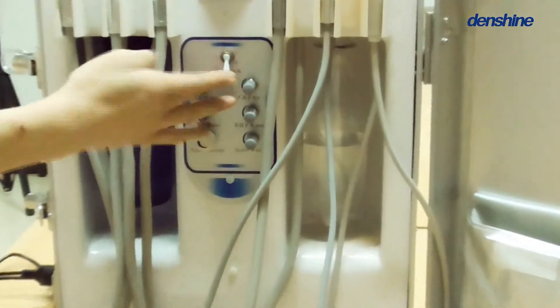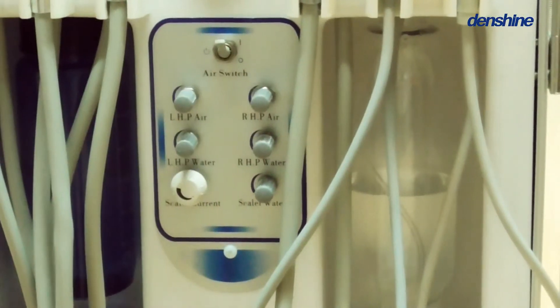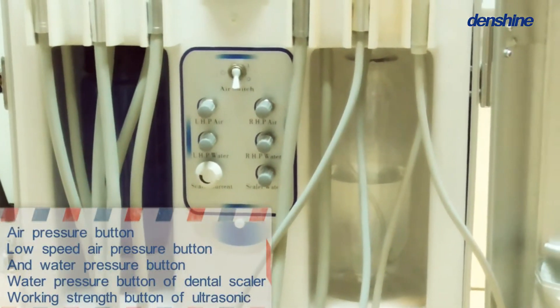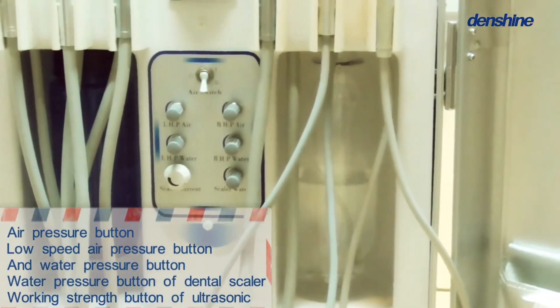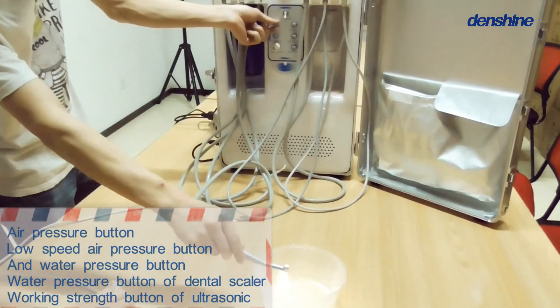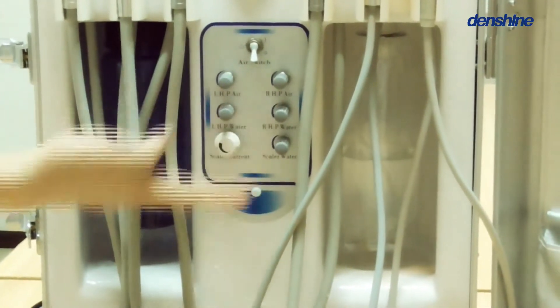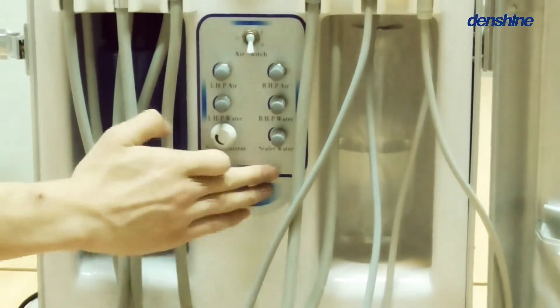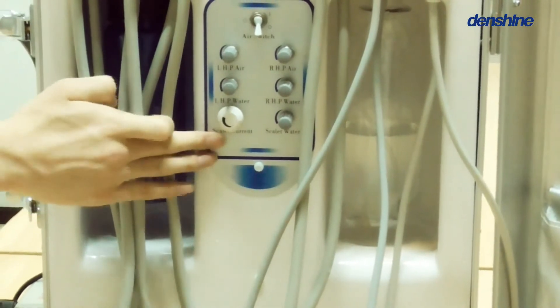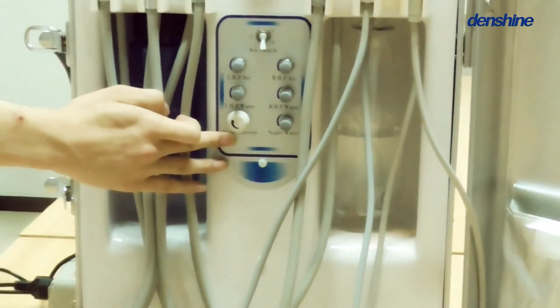In the end, let's identify the buttons on the unit. This is the deflation valve — turn it up to deflate and turn down to inflate air. Air pressure button. Low-speed air pressure button and water pressure button. The dental scaler working strength button.